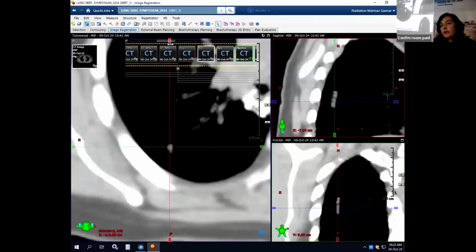Like you said, quality assurance is important at every level, starting from when the patient comes in and we go through the MDT to select patients, right through the CT and imaging studies and until the treatment process. So we ensured that our imaging was correct and that there were no images missing, and this was actually a good 4D CT.